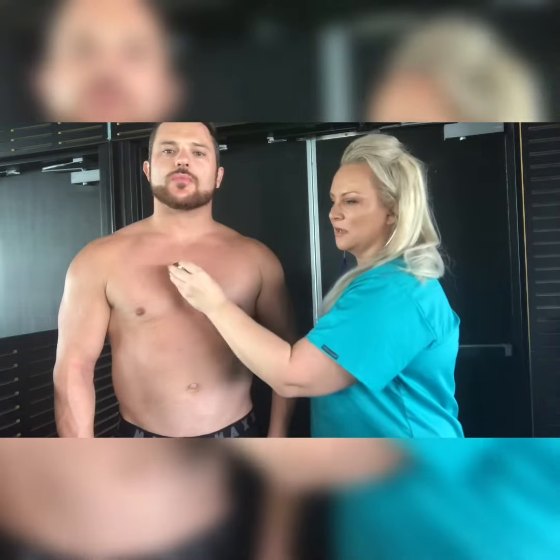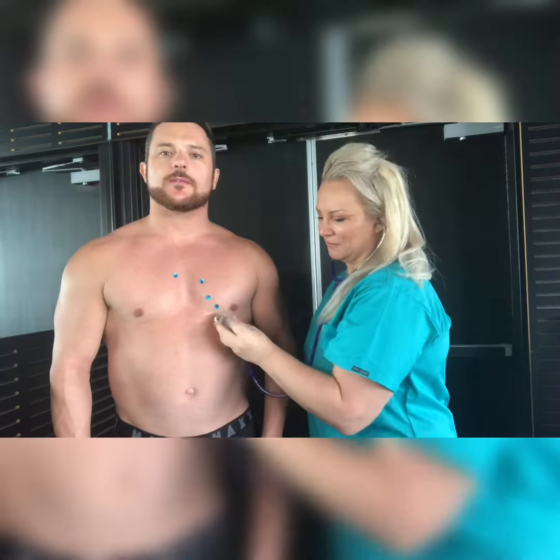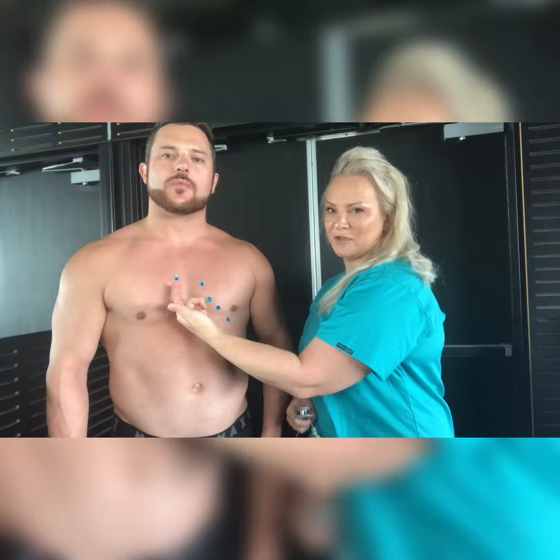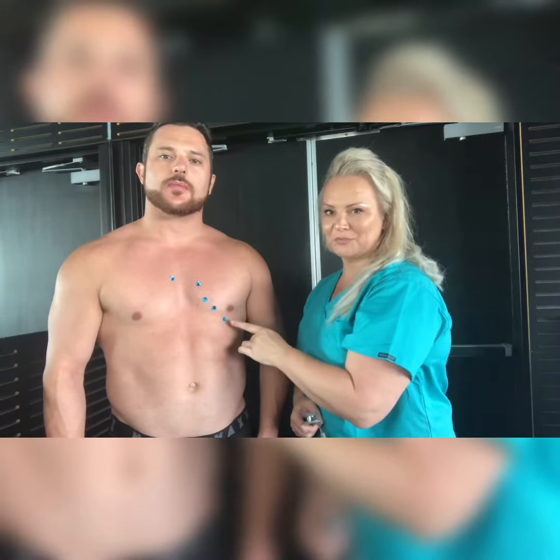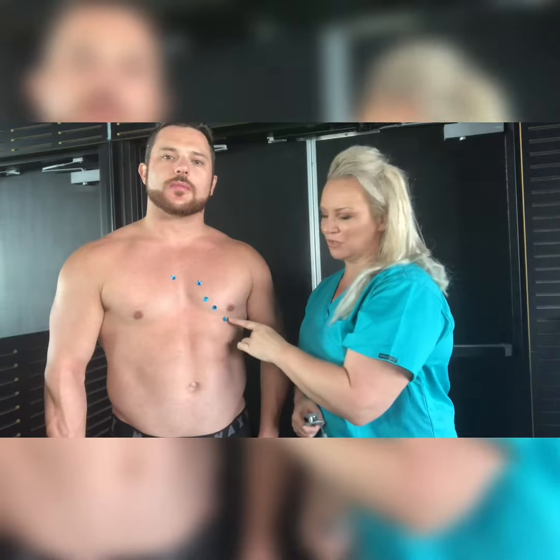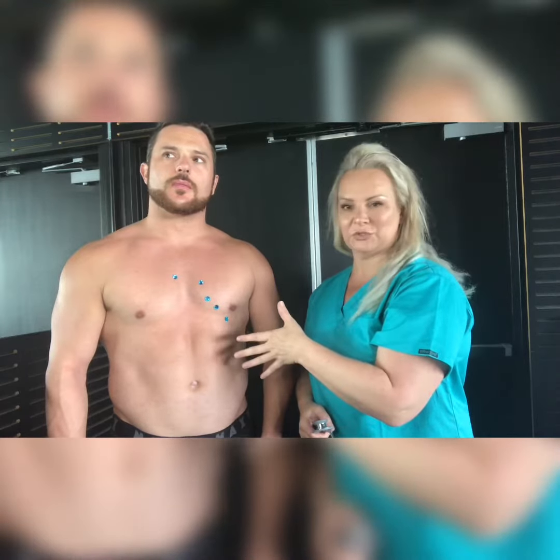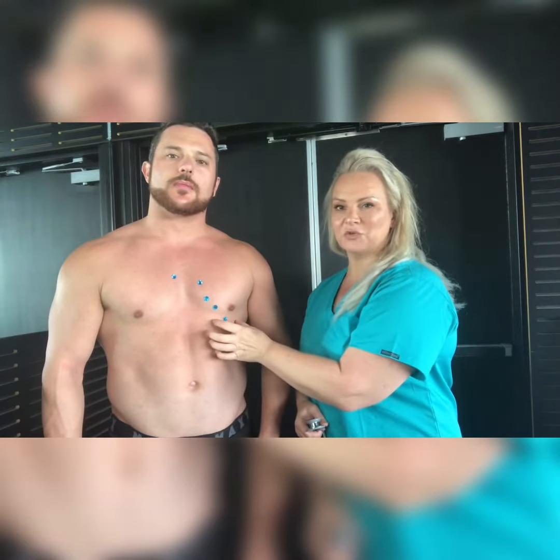Make sure the ear pieces go down into your ear canal — give a gentle tap to make sure it's on — and use the diaphragm side. Remember: All Pigs Eat Too Much — Aortic, Pulmonic, Erb's point, Tricuspid, and Mitral. For a basic heart rate, go straight to the mitral. If the patient is female, ask her to lift her breast so you can hear underneath and access the mitral valve.